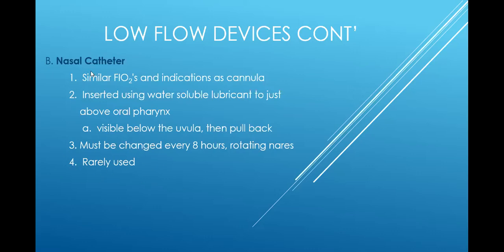But you do need to know that the nasal catheter must be changed every what? Every 8 hours, and rotate the nares. So you pull it out of the left one, put it in the right one for 8 hours. After that, pull it out of that one, put it in the left one for 8 hours. It can cause trauma by sticking and making you bleed, because the nose is very, very highly vascularized, right? And it can bleed easy. So that's why we don't use it that much, okay?